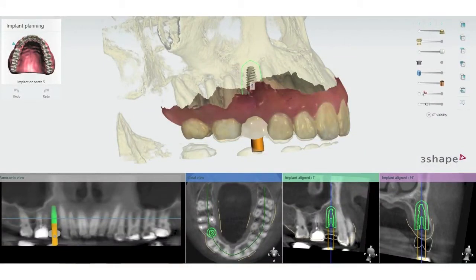Okay, so back to TEDRA. So here's TEDRA. The intraoral surface scan has been merged with the CT scan, and a basic plan has been made. My involvement to this point has been sending the CT data along with the intraoral surface data, my TRIOS data, to the laboratory and saying, I want to put an implant into area number 5. All this has now happened behind the scenes. Ro now has technicians that are expert in planning, creating the plan.